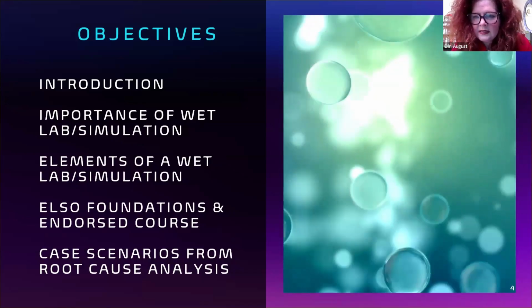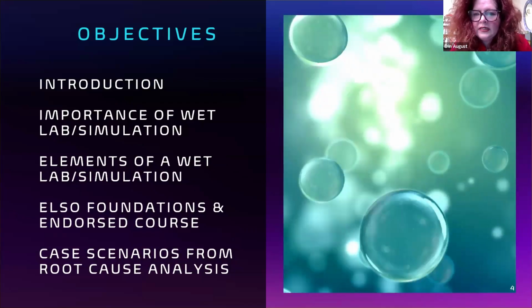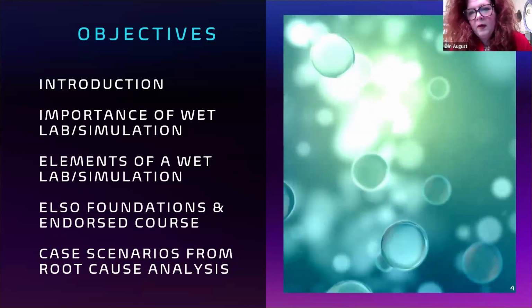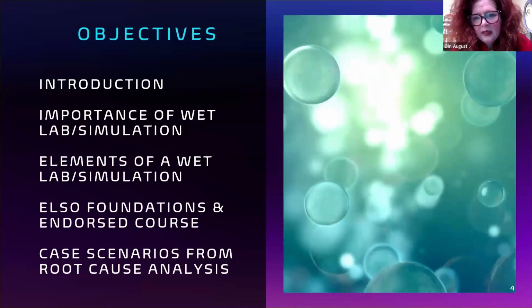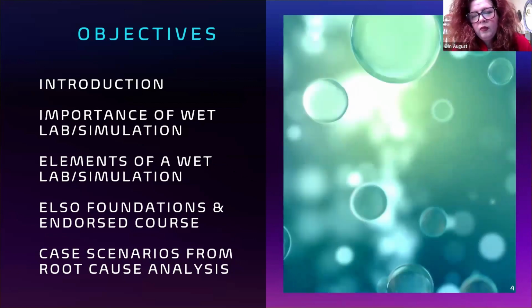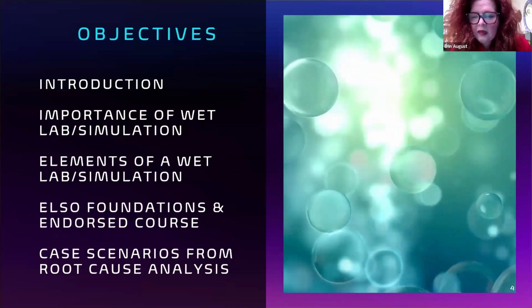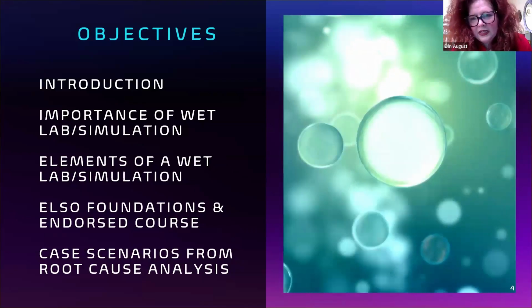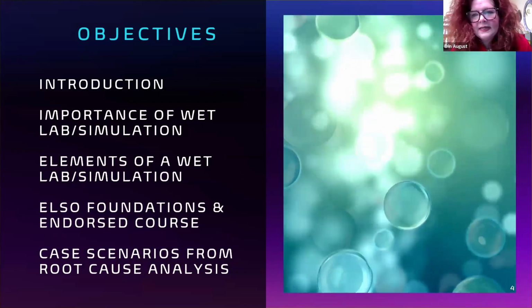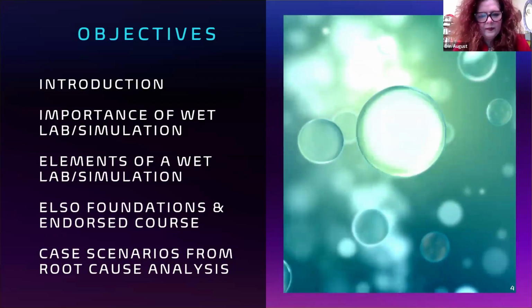Here in the United States, for the program I'm currently at, Cleveland Clinic Florida, as part of our quality assessment process improvement, otherwise known as QAPI, we review any incident that may have happened and ask what worked, what didn't work, and how we can do it better. If anything clinically happens with the equipment or technique, we take it back and work it into our simulations and wet labs to make a final loop on our root cause analysis, by doing continued learning from an incident.